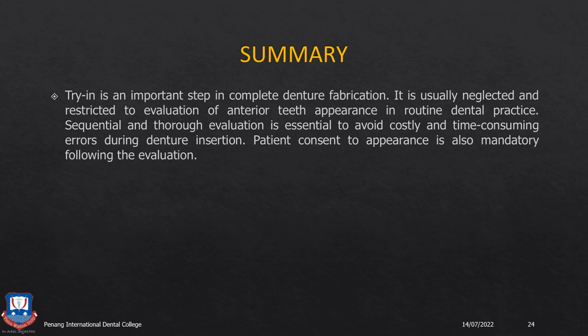So I hope you got to take away some notes from this lecture. And basically, it is not a very big step. If the jaw relationship records are done properly, you should not face any problem during the try-in and insertion.